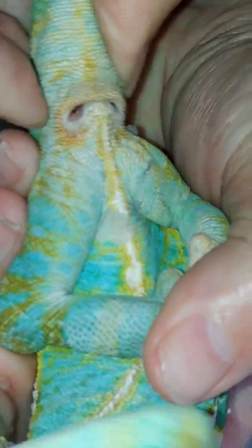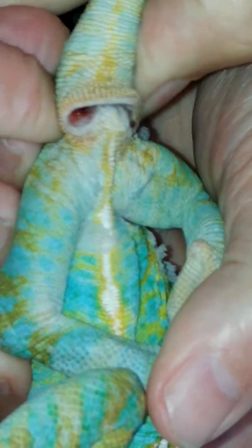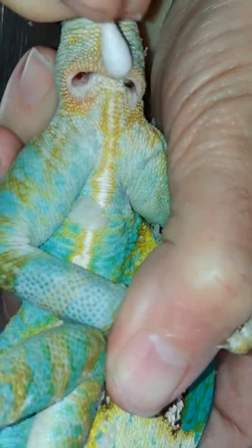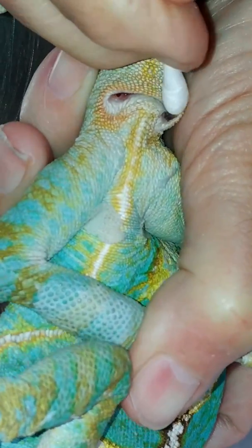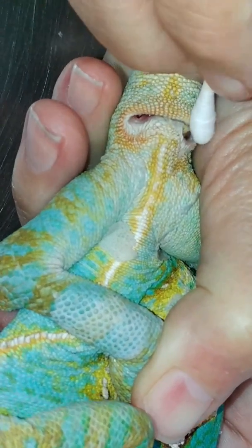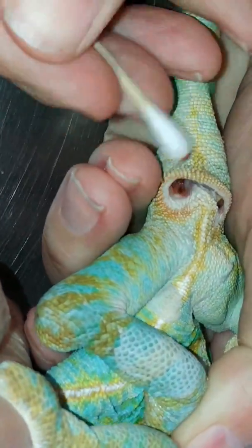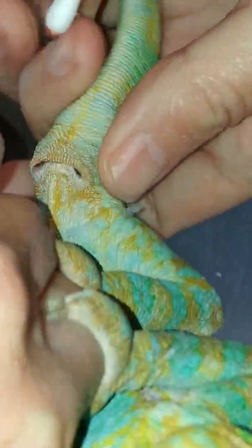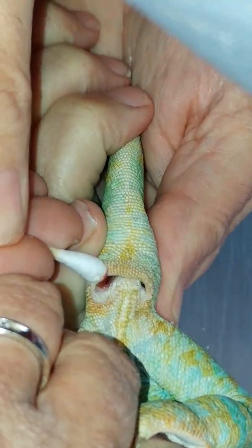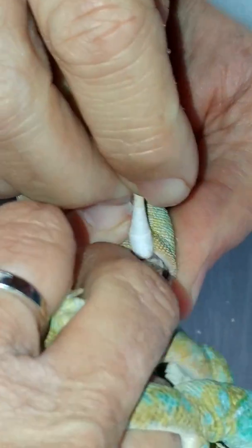These are just kind of like a mucus plug that develops inside the male reproductive organ called a hemipen. They have one on each side. This is fairly normal. Now over here — that one looks like it's probably infected because I can see that it's swollen, and it's red down in there. A little bit of bleeding with just very mild manipulation.